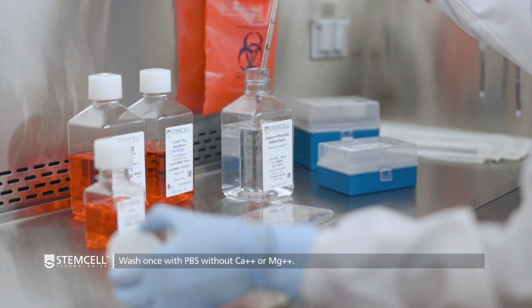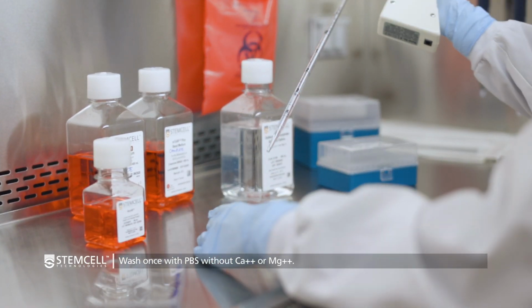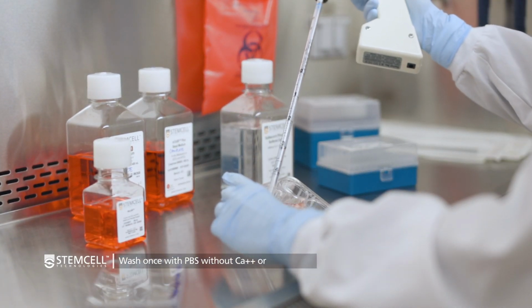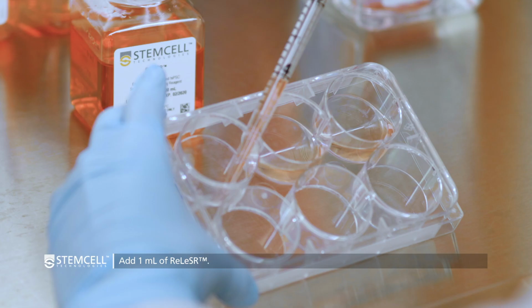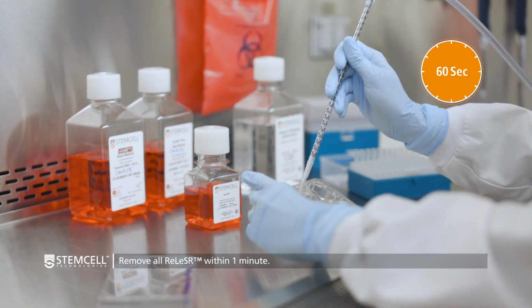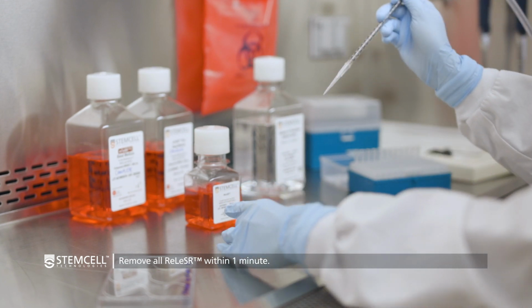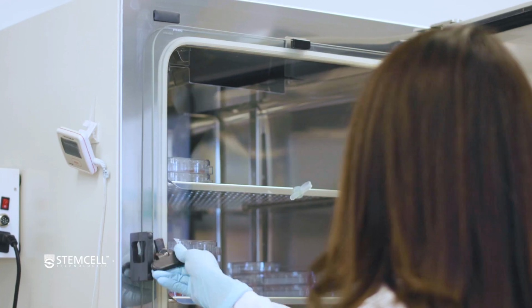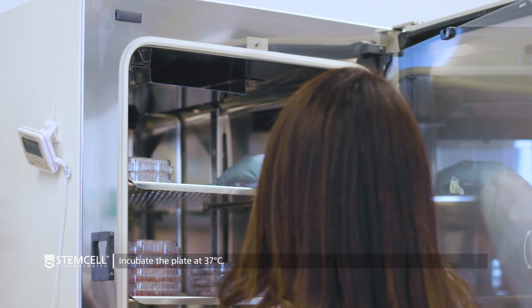If you passage using ReLeSR, begin by washing each well with 1 milliliter of PBS without calcium or magnesium. Aspirate the wash solution. Now add 1 milliliter of ReLeSR to the well, and aspirate all of the ReLeSR within 1 minute. It is not recommended to leave any ReLeSR on the cells for the upcoming incubation time. Then, incubate the plate at 37 degrees Celsius for 5 to 7 minutes.